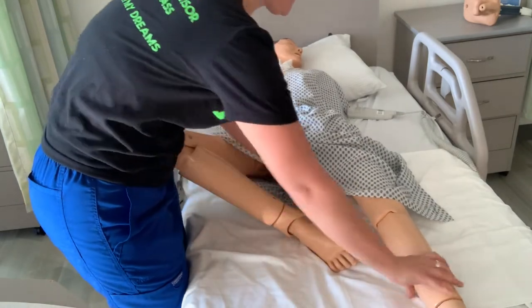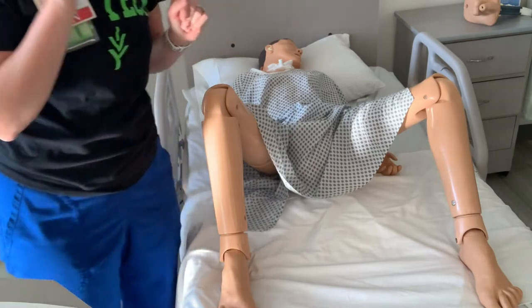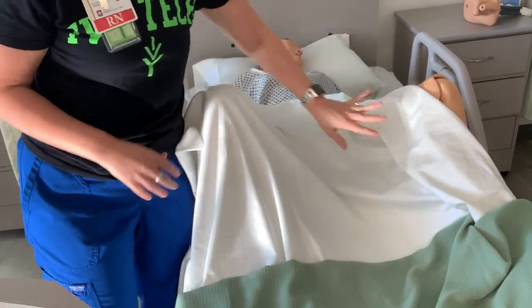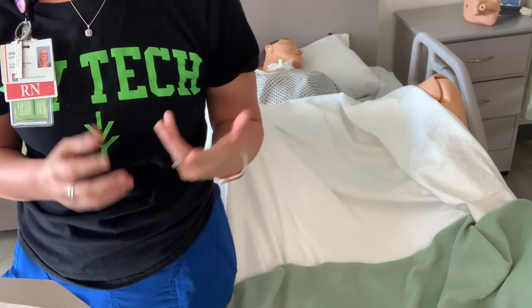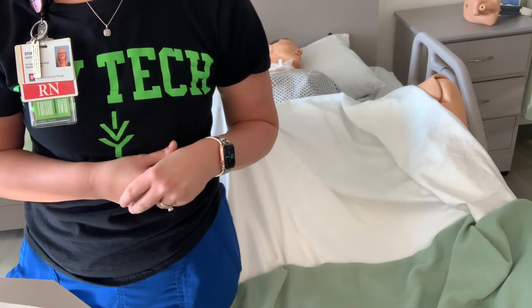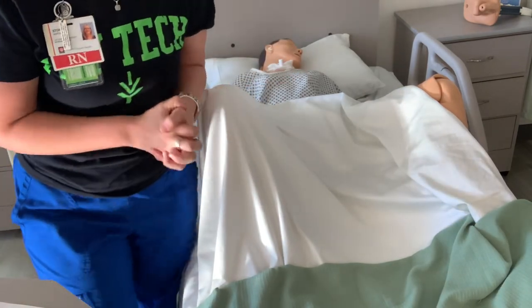Dorsal recumbent position means frogging the legs out, giving us good access to the area. These mannequins are a little hard to maneuver. Always make sure we're keeping our patient covered during the times that we're not needing to access their body parts, so we cover her back up with the sheet. On your check-off, step two: assist the female patient to flex her knees, assist the male patient to spread their legs apart. Your check-off is usually on a female patient, and then at the end we ask what you would do differently for a male. Next step: provide perineal care if necessary. If they look dirty or have an odor, we're going to do a little washing before we put this sterile catheter in.